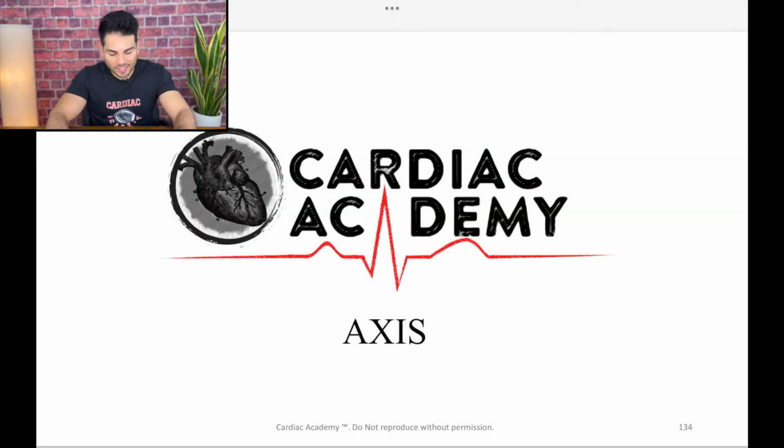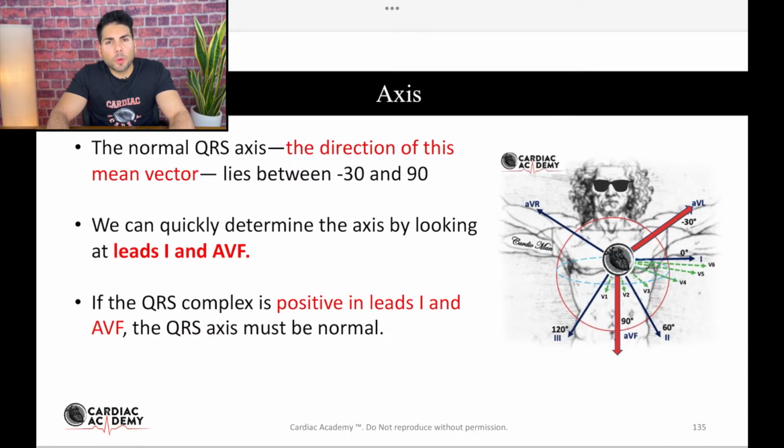Okay, let's talk about axis. When we talk about axis, what we're really looking for is the direction of the vector of depolarization. If you remember from our previous lectures, all depolarization should start at the SA node, and from the SA node it will travel down to the AV node, and then from the AV node down the His-Purkinje system to the ventricles and depolarize, right? It does so in a rightward to leftward direction, and from the top of the heart to the bottom of the heart. So if we look here at what is called the hexaxial reference system, we should see that that depolarization should be between -30 and 90, just like we see here.